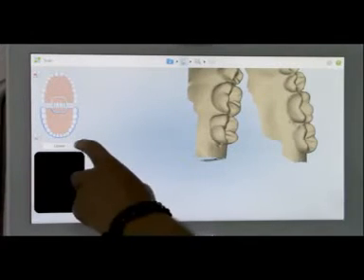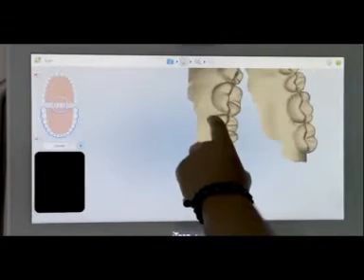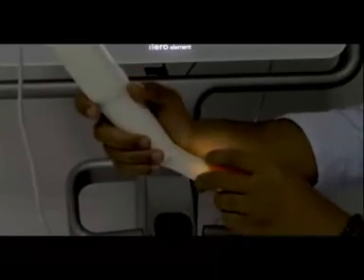No? Okay. So we're finished with the lower, then we're gonna, wait, let's see what other selections we have. That's fine. And then we go up, so that's the upper. Again, you want to be sitting behind the patient, and you want a nice contact, like that.